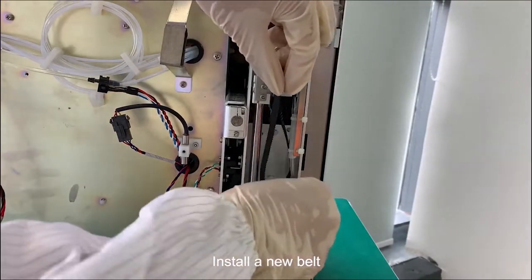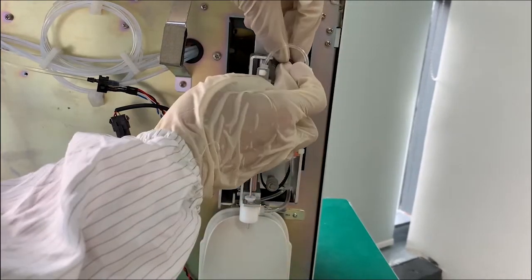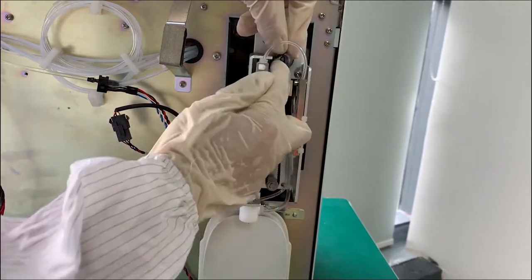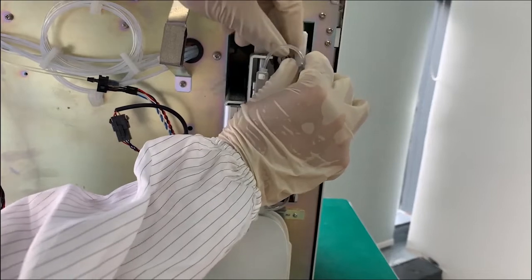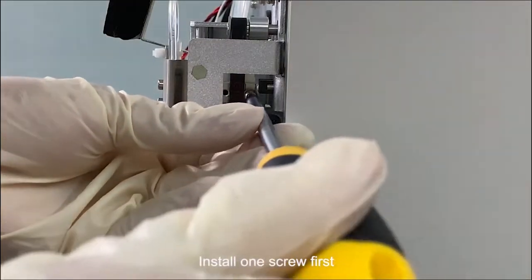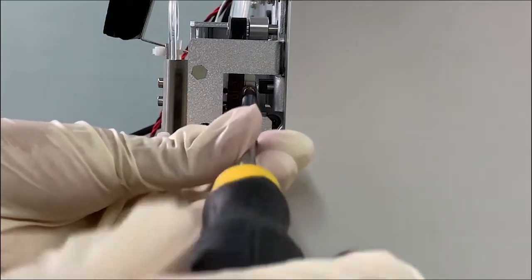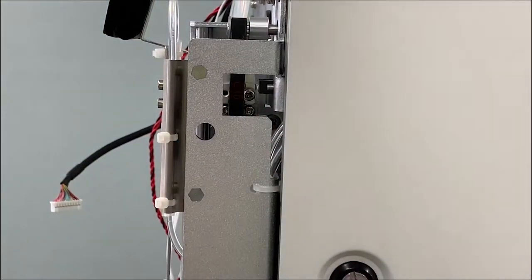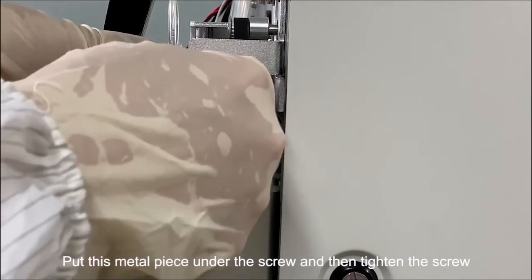Install a new belt. Install 1 screw first. Don't screw it too tight. Put this metal piece under the screw and then tighten the screw.